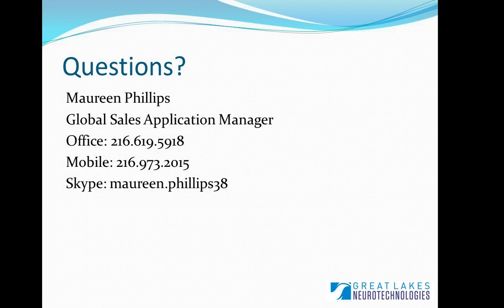Thank you, Dustin. What we wanted to do today was just provide a nice overview of some of the different processes that you can use for physiological signal analysis. So like Dustin discussed, you have your Fourier transform, the frequency analysis component. There are wavelet options, the neural network options. So again, this is more of a top-level overview.